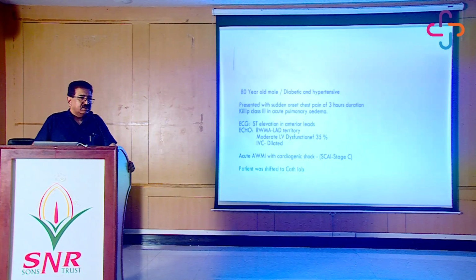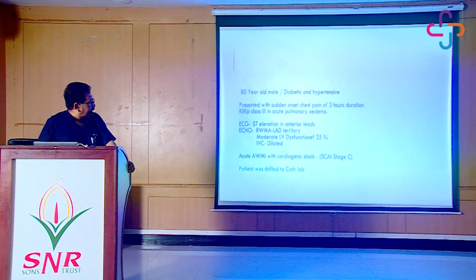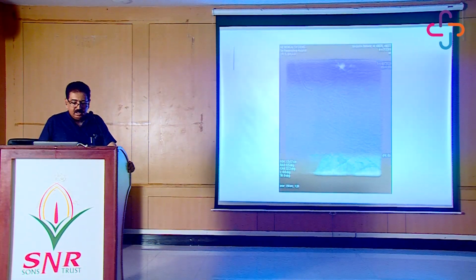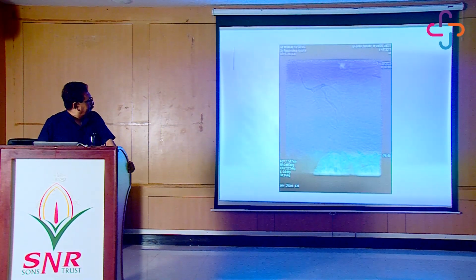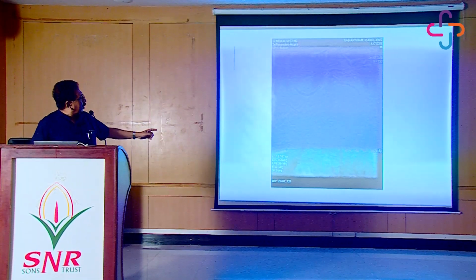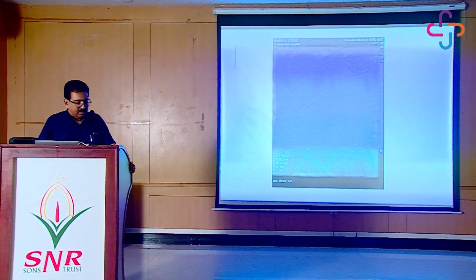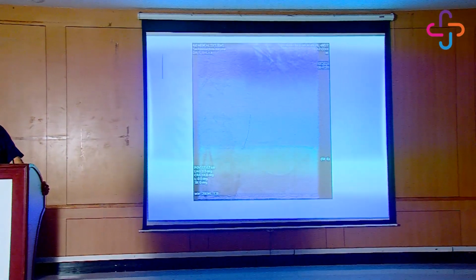The other tool which we have is intravascular lithotripsy. So one was cutting balloon, second is rotablation. Third tool which we have is intravascular lithotripsy. This was an 80-year-old gentleman who again had chest pain, previous stenting done. He presented with an anterior MI, and you can see here on top the LAD is completely occluded. This was at 4 o'clock in the morning. This was a primary angioplasty.